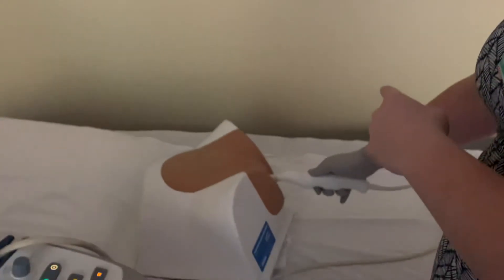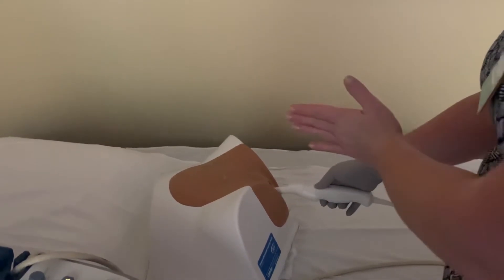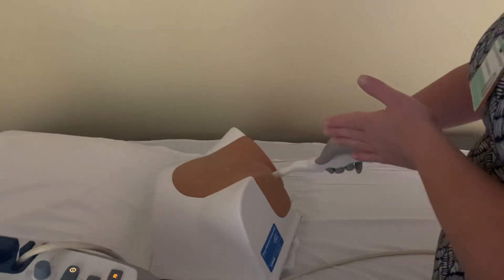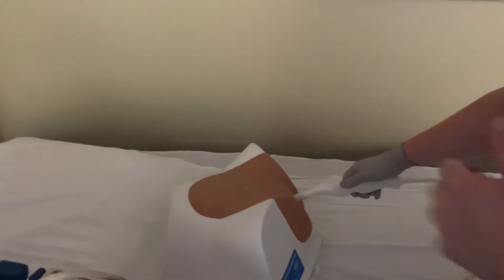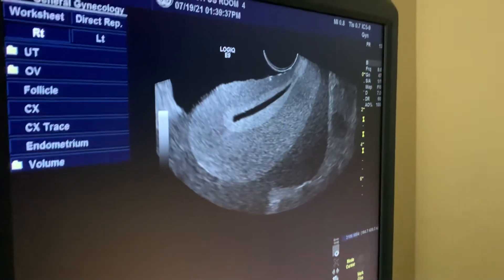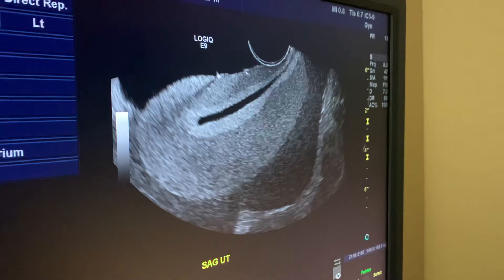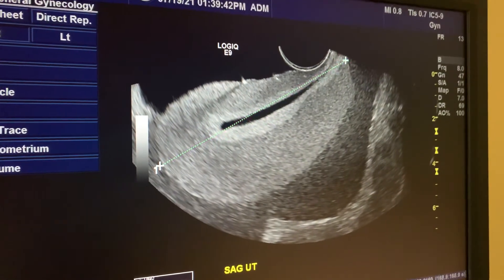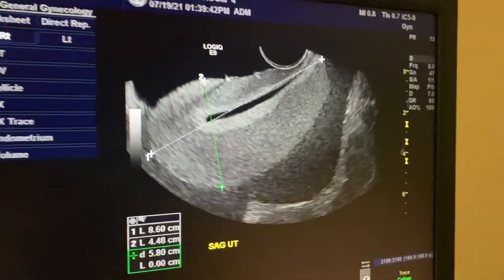When sweeping left to right it's like a flashlight — if I bring my handle towards me, the probe goes to the patient's left; if I move the handle away from me, the probe goes towards the patient's right. Pay attention to laterality. We follow the same protocol transabdominally and transvaginally — we start with sagittal uterus, take that image, then measure it in sagittal and AP.